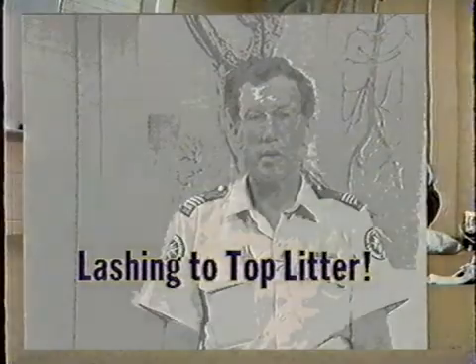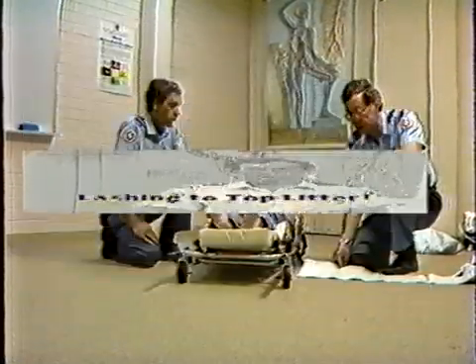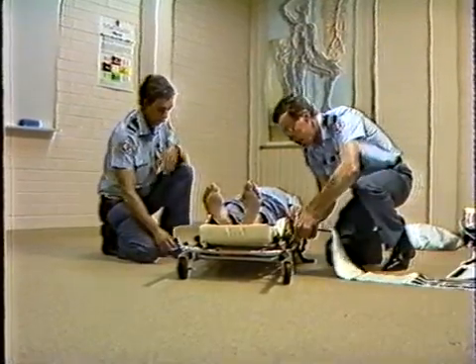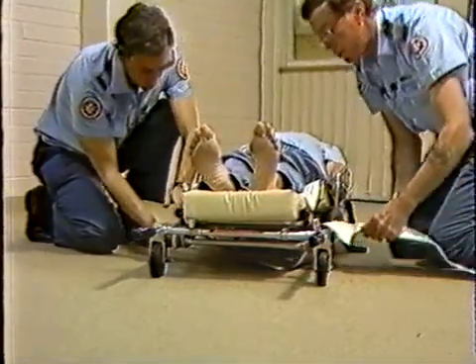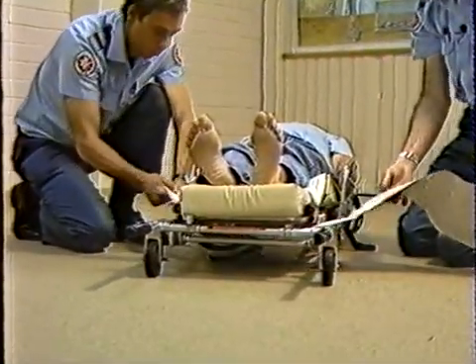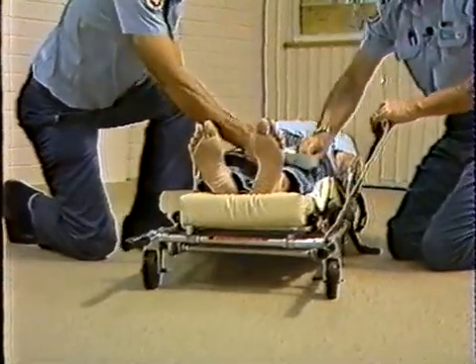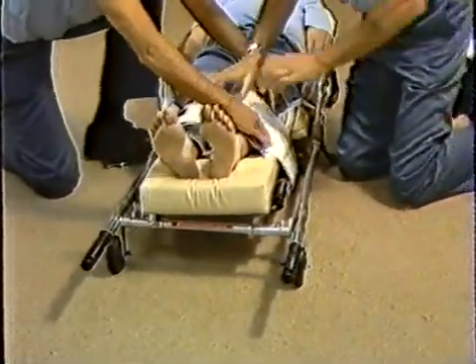And you require the patient to be lashed to the stretcher where the 2 seat belts are insufficient for that job. So the way we do it is, get the medium one, we go down inside the rail, across, and the offsider pulls it through the other side. Bring it back up to near the knees. He brings his leading edge over, and there's the lower legs.